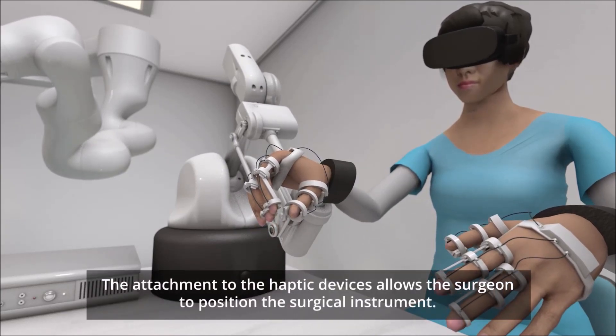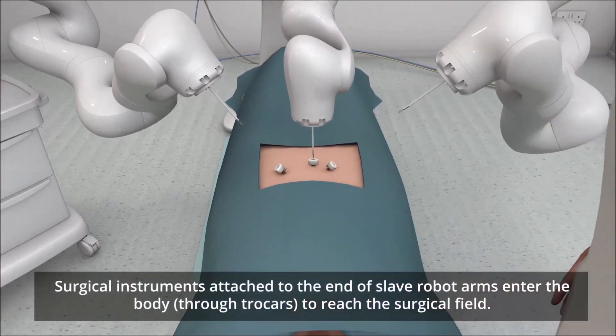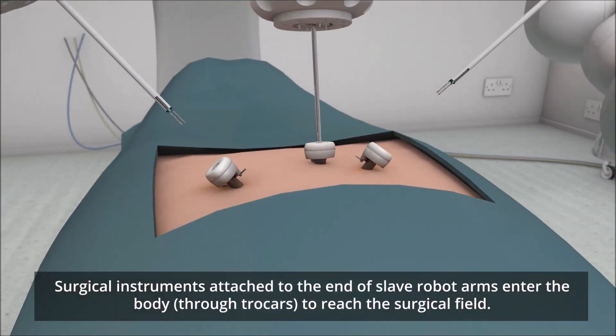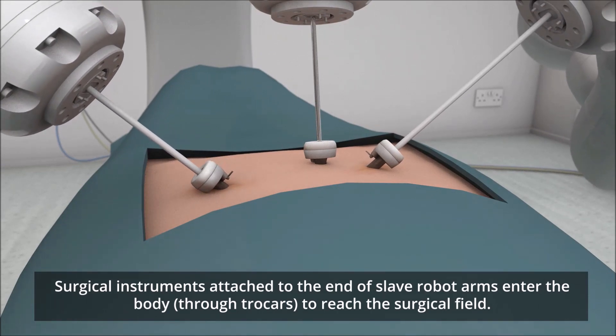The attachment to the haptic devices allows the surgeon to position the surgical instrument. Surgical instruments attached to the end of the slave robot arms enter the body through trocars to reach the surgical field.